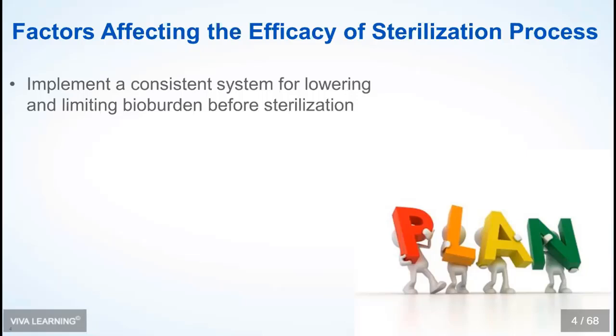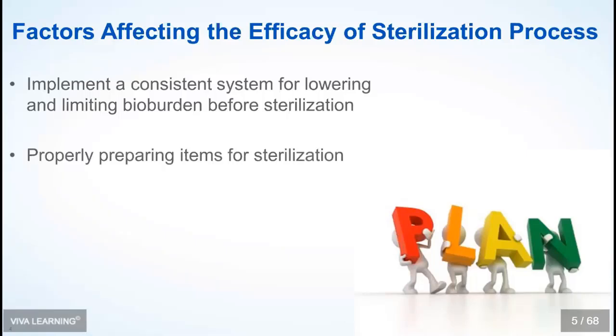Before we get into the actual sterilization process, we need to make sure that we're doing the appropriate cleaning, because you cannot sterilize a dirty instrument. Any type of debris or organic bioburden left behind on the instrument could prohibit the sterilant from reaching the instrument itself. Properly preparing and packaging the instruments for sterilization.